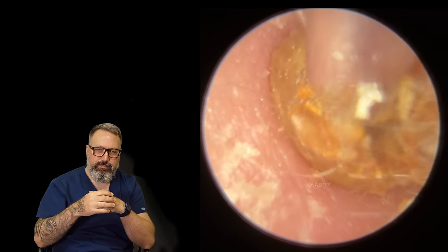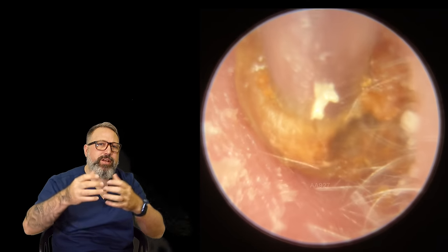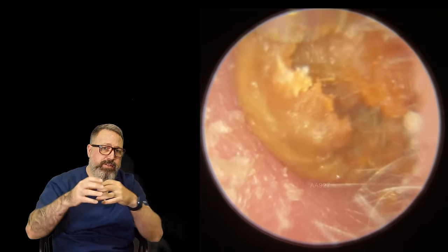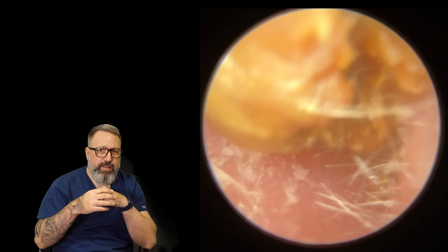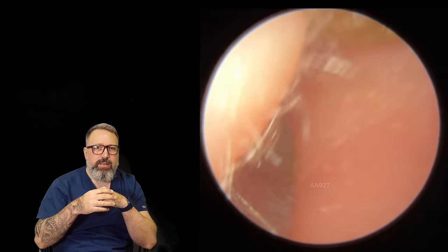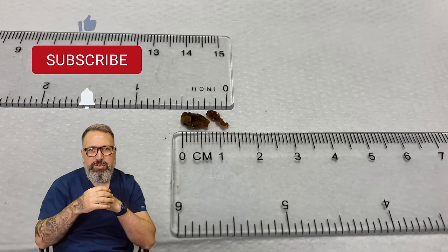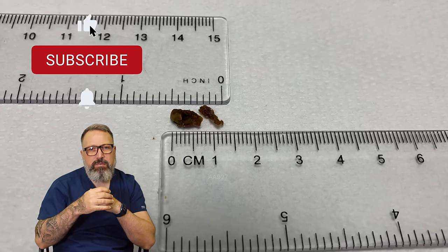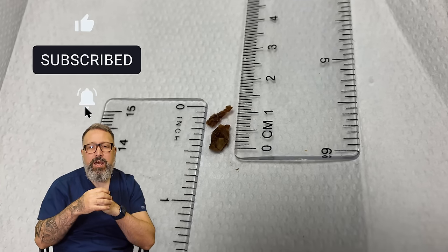So we're just taking this away. He's pulling down from the top section of this plug, trying to almost roll this out of the ear canal, and he's doing a good job. It's coming away. Can you get the whole thing out? Yes, he can. There you go - managed to get that away. Eardrum looking good there, no real issues as far as that drum is concerned. So we are just over one centimeter, half an inch worth of ear wax there.